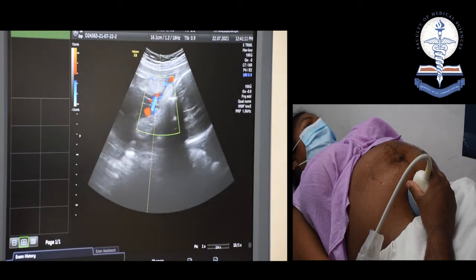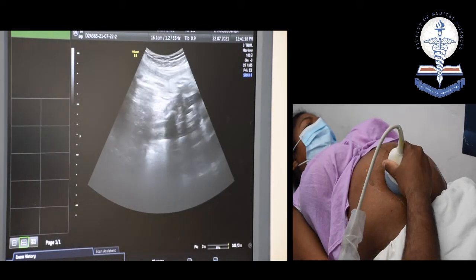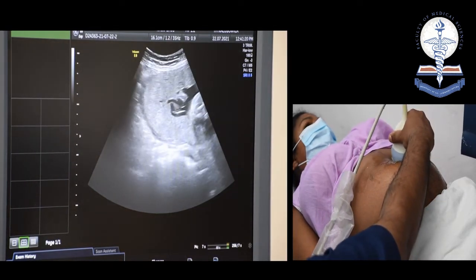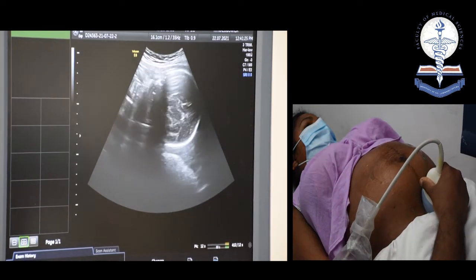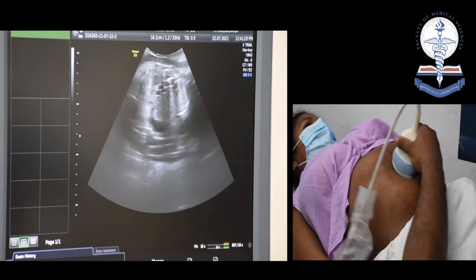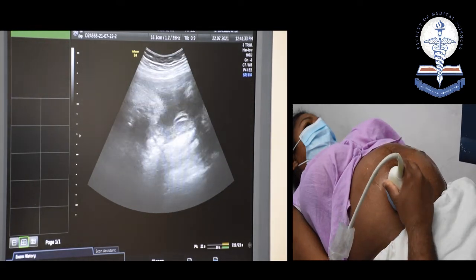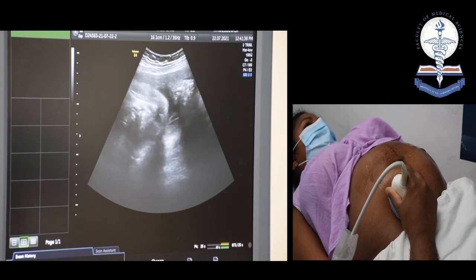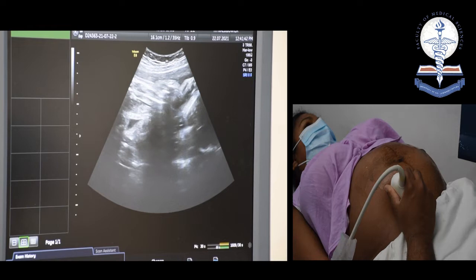She's 37 weeks, so now we are thinking of delivering the baby. The placenta is in the fundal area. The presentation is cephalic, that's the back and that's the breech. All that, we managed to get right, and the fetus is small. Liquor is also reduced.